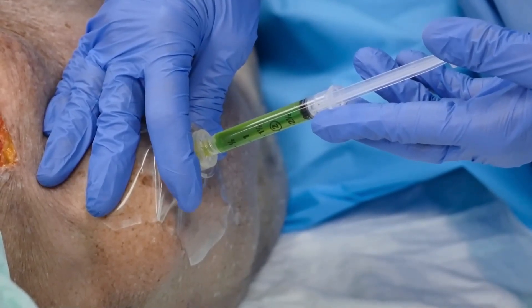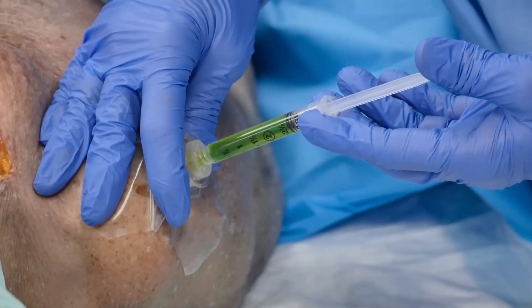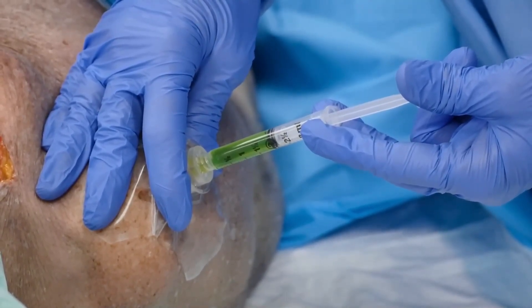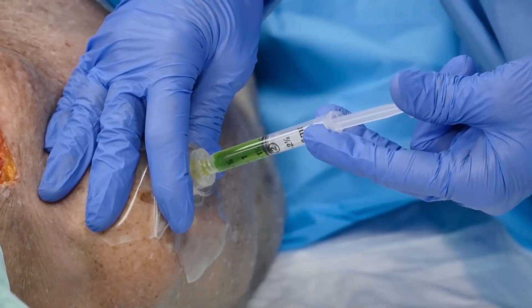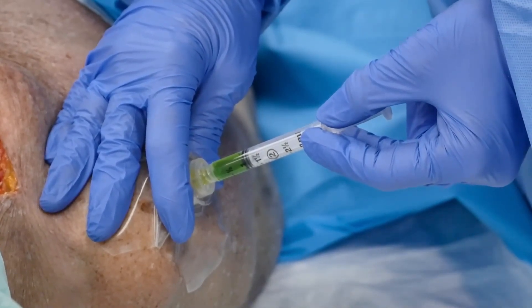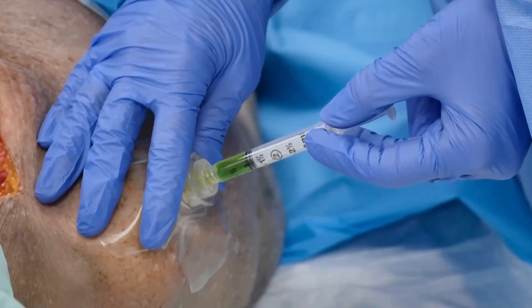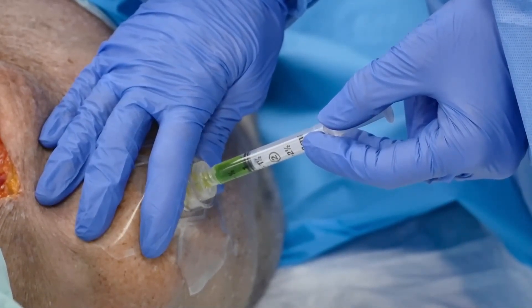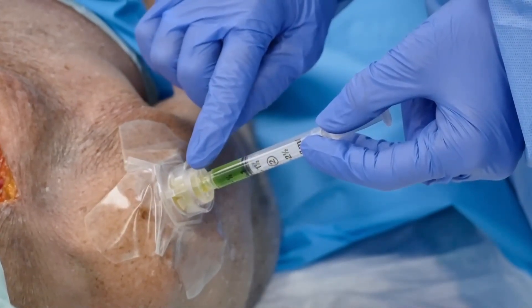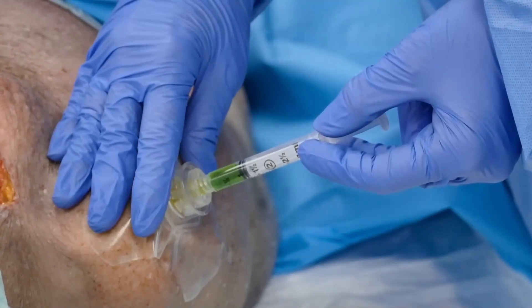The first dose is going to be two mLs or 40 milligrams, and we're going to infuse that over two minutes. Now that we have that infused, we're going to allow it to dwell inside the medullary cavity for one minute. That's really going to bathe those nerve endings in lidocaine and numb up the inside of the medullary cavity. This slow infusion allows the medication to stay inside the medullary cavity and not move into systemic circulation.